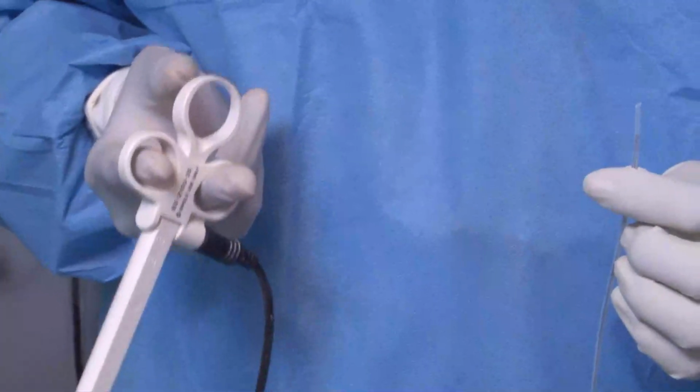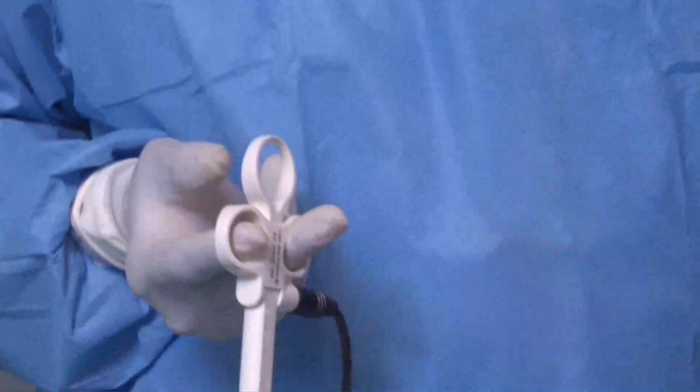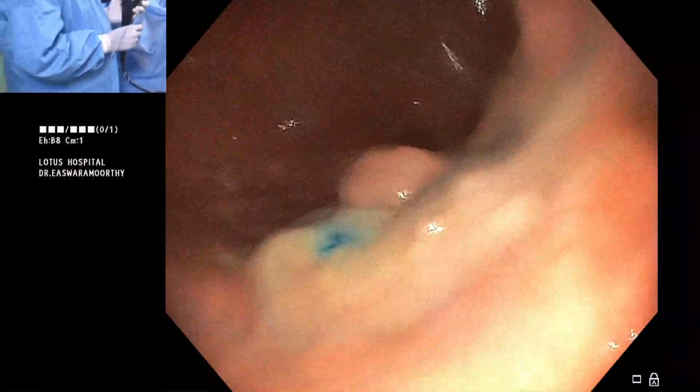And also people may not know what a cheese wiring effect is. Without diathermy, they can cut through. These types of things are very easily damaged. So that is what I wanted to demonstrate. As I said, the trajectory is very, very important.